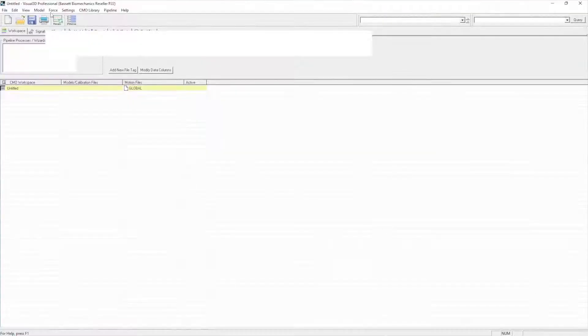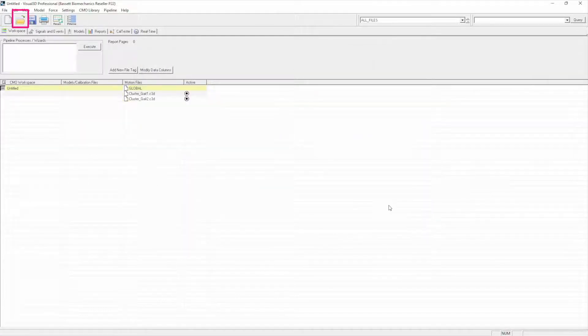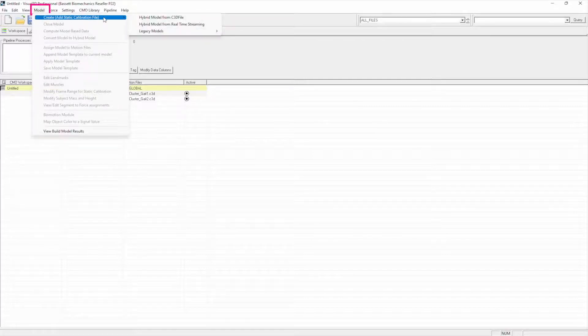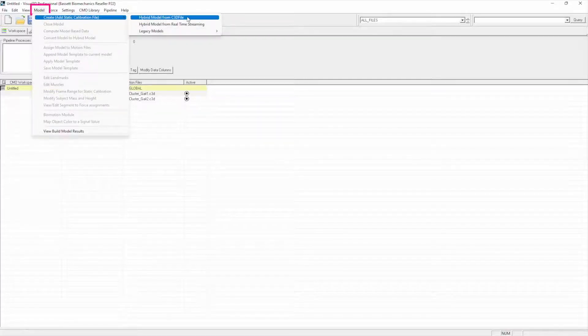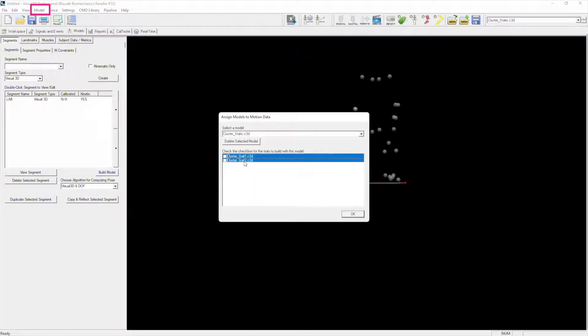In Visual 3D, if we just go up here to Open and pick our cluster gate 1 and cluster gate 2 files and click Open exactly as we did previously, you see they load in here. Now, if we come up here to Model, Create, Add Static Calibration File, Hybrid Model from C3D file, you can see we can open that static calibration file just as we did in the previous unit.